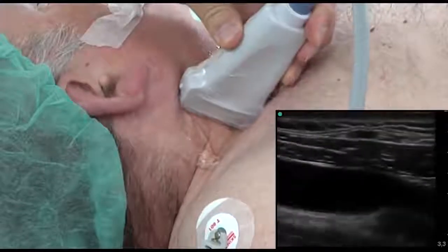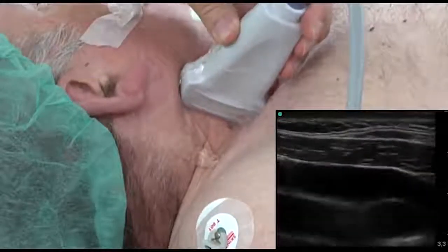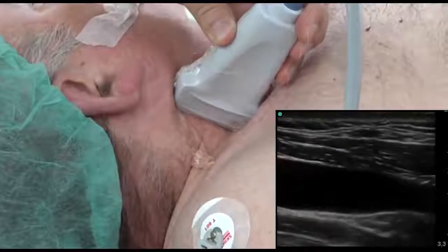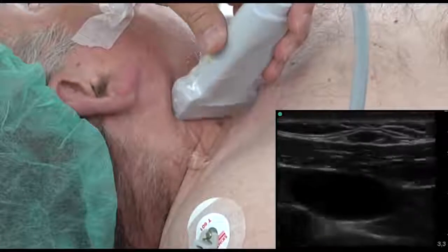On the long or longitudinal axis, the internal jugular is more superficial than the common carotid. To ensure safety during the puncture, it is convenient to move the transducer laterally until the carotid can no longer be seen under the jugular.